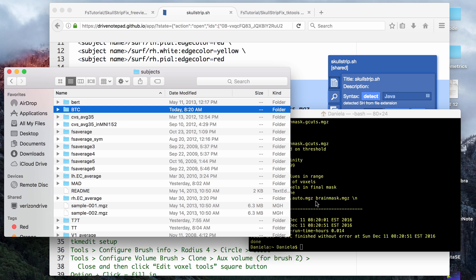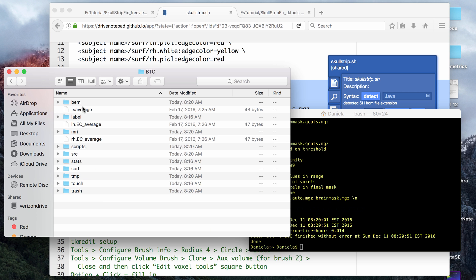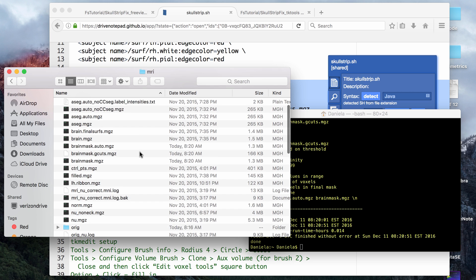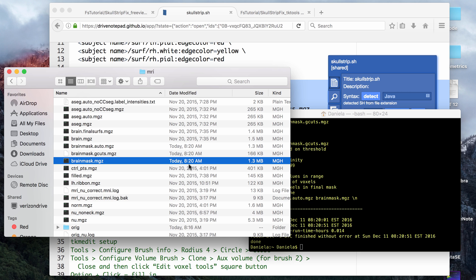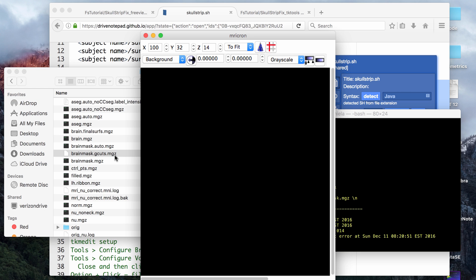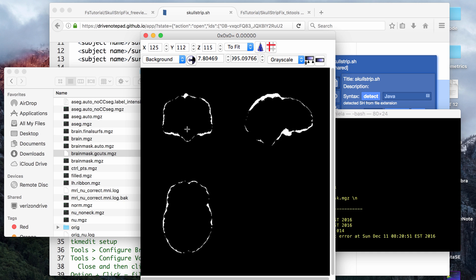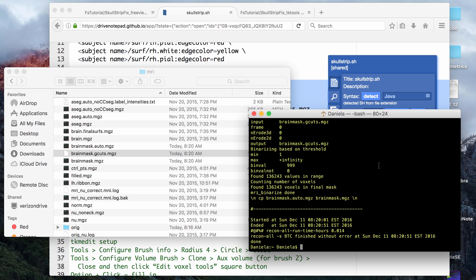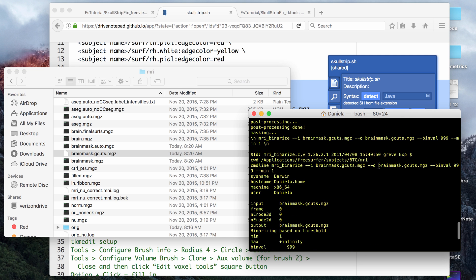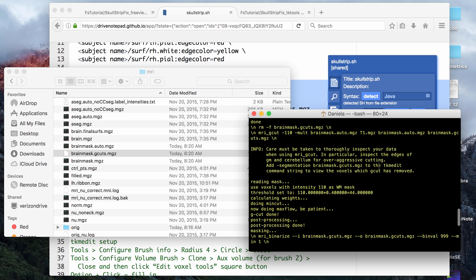It will tell you to just use the brainmask file that's automatically produced, but in this case it did successfully produce a gcuts file. You can go to your subjects folder, and then your MRI folder, and you will see that there's now a gcuts file produced, and it will also update your brainmask file. If you click the gcuts file, it will show you the additional non-brain tissue that has been cut out.